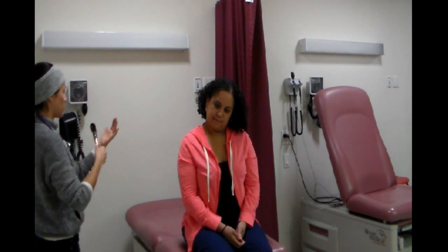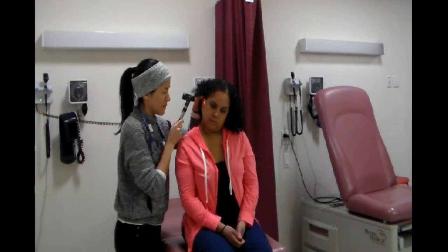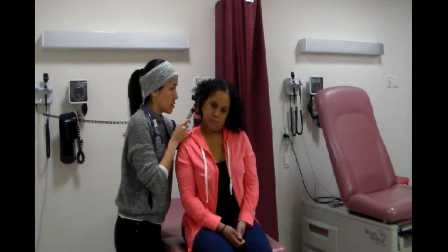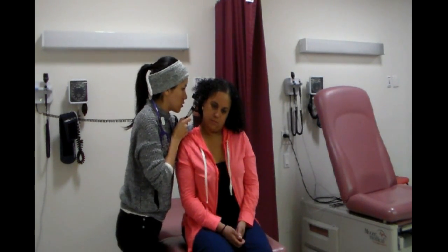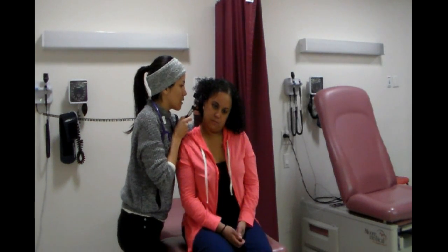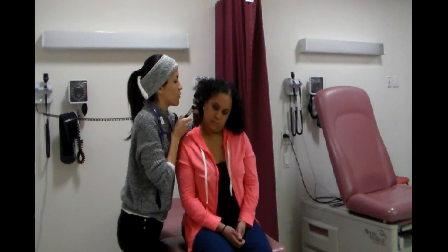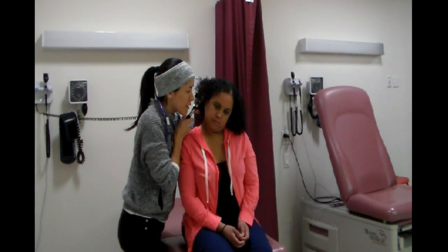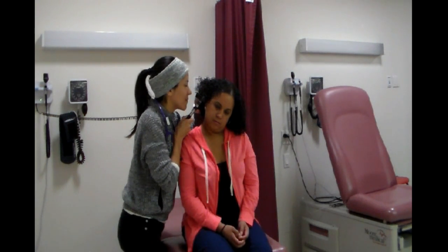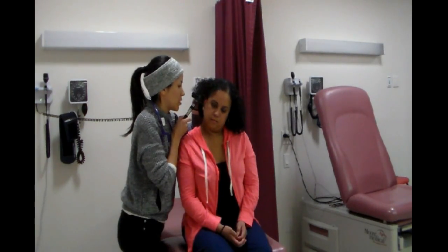I'm gonna look inside your ear. I'm gonna pull the ear back and up and look inside. I'm looking at the tympanic membrane to make sure that it looks pale, shiny. There's no bulging. The cone of light is anterior, inferior. I can see the malleus. There's no bulging, like I said, no redness. I don't see any discharge.